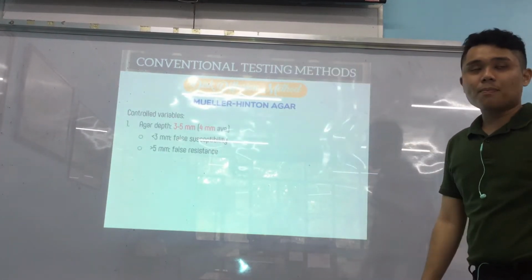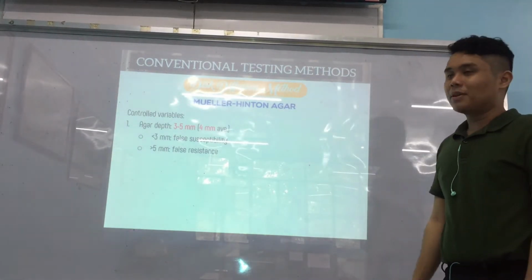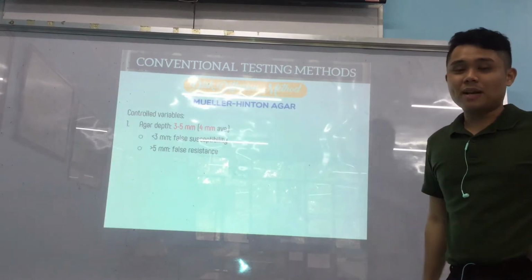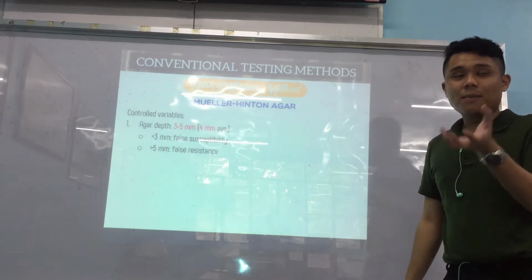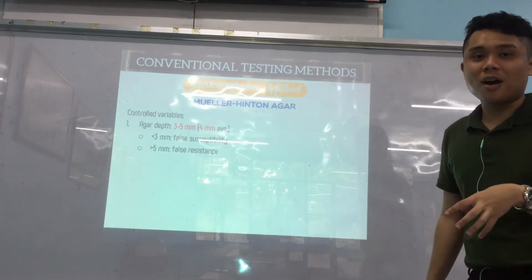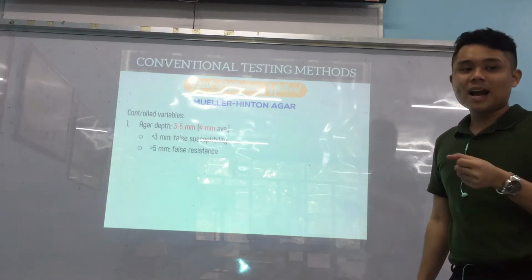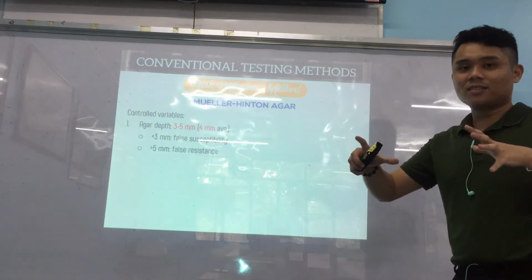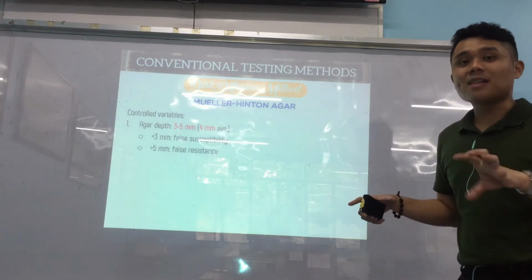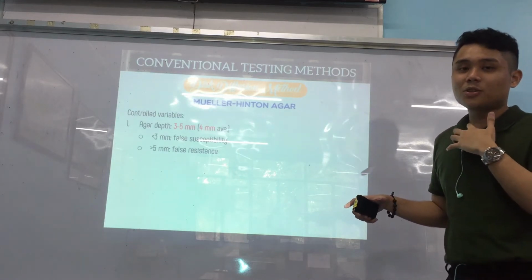Starting with agar depth, it should be about 3 to 5 millimeters, and the average is 4 millimeters, because if it's greater than that, it's a problem, and if less than that, false susceptibility, kay nipis ra ka imuhang media. So, therefore, dili kayo mo tubog tarong imuhang kagaw. So, pagbutang nimo sa antibiotic, nya gamay ra kayo ni tubo. So of course dako gyud kayong effect ang antibiotic against the kagaw kay gamay raman ang naa, di ba? So pwede siya false susceptible.